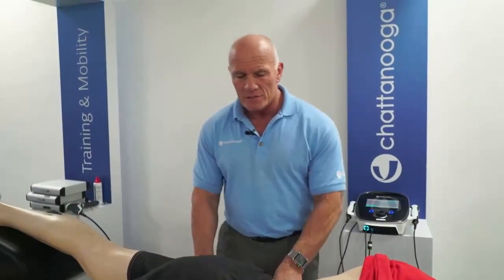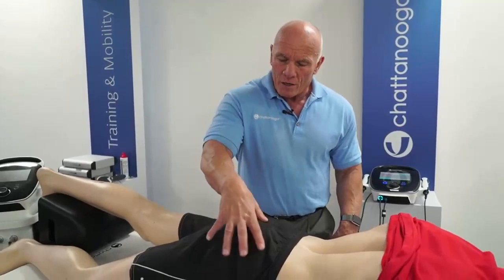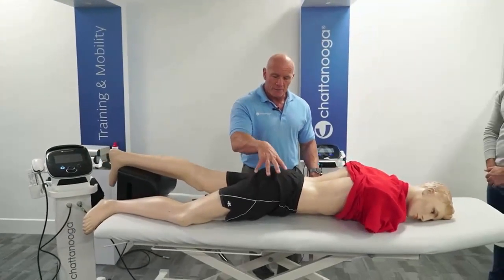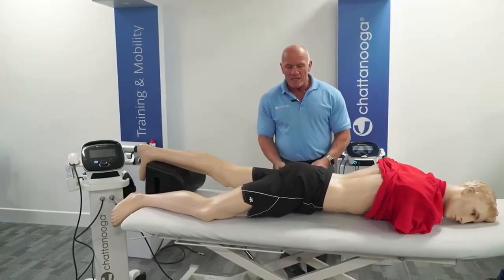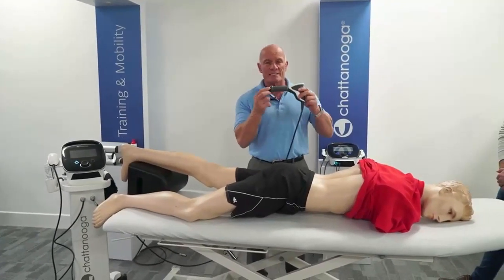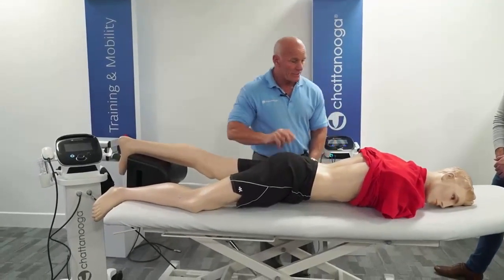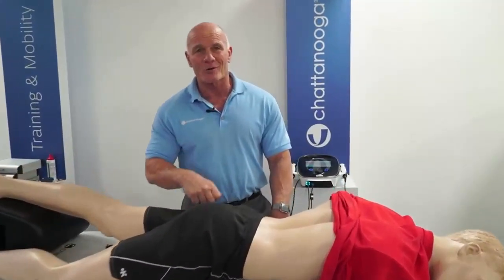So if I had a patient with this presentation, I know that I'm going to find a myofascial trigger point in the gluteal muscles. Therefore, I'm going to select my D20 transmitter. But you can see here, Fred, as hard as nails, obviously works out quite hard.